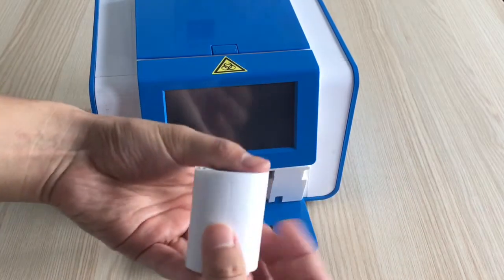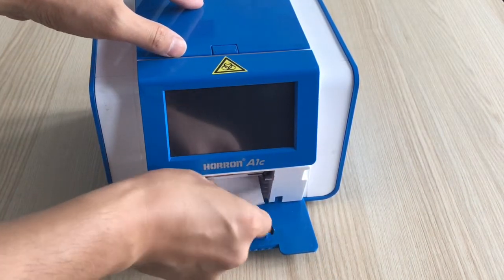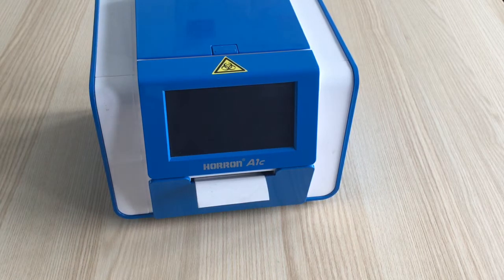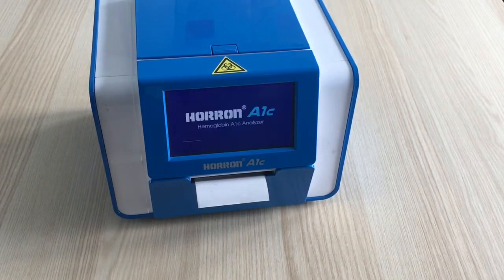Let's install the printer paper. Please pay attention to the sides. And connect the power cord. Now we can power on the machine.